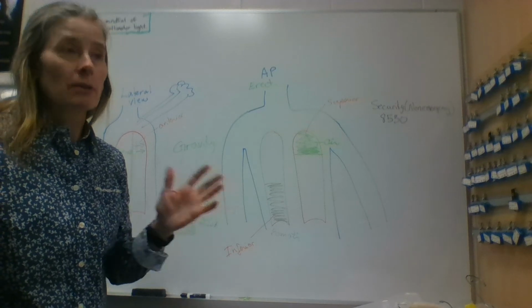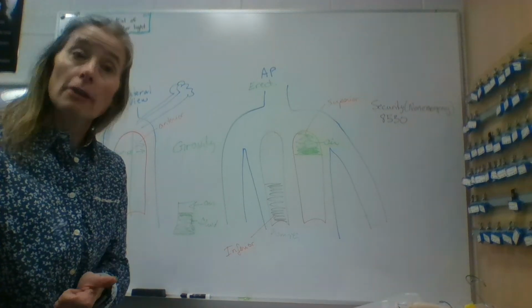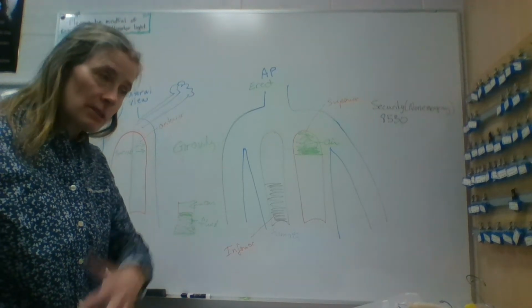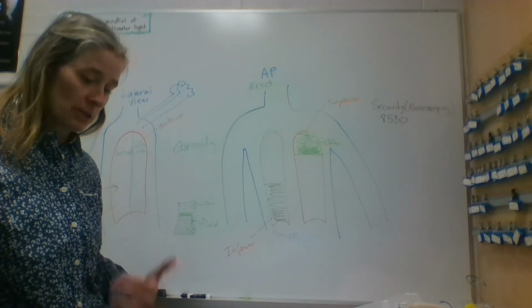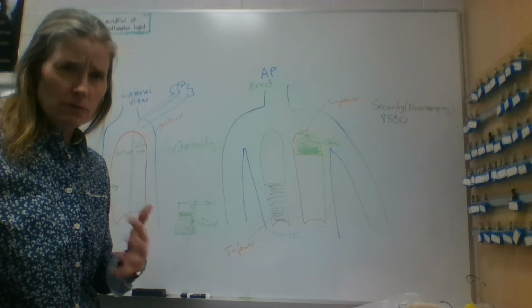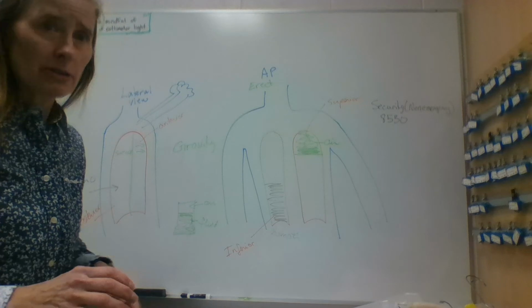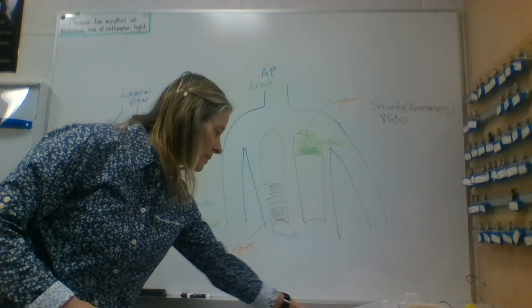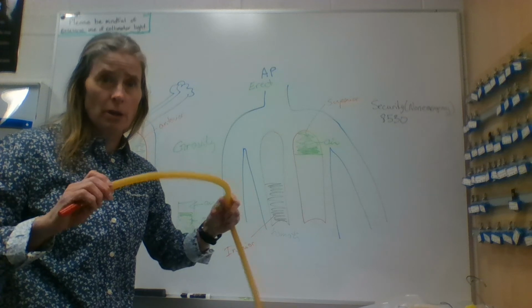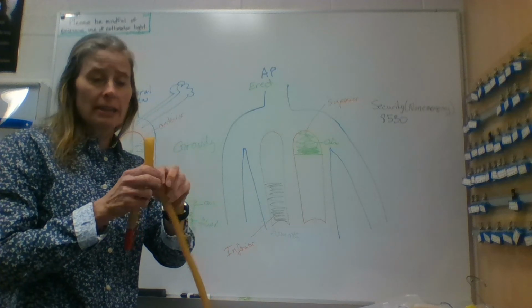Please make sure you wear gloves when you're handling them. It's important to keep the patient's modesty, but with blankets and sheets, we need to make sure the chest tube itself is not hidden and could possibly be dislodged. These can get kinked.